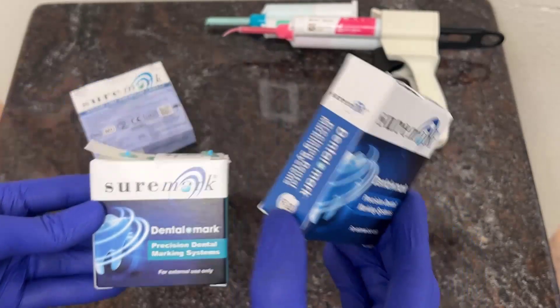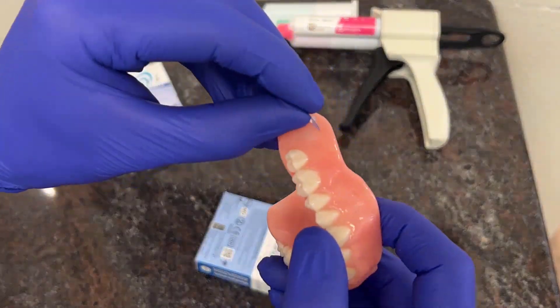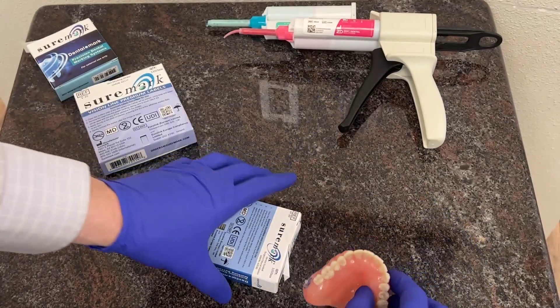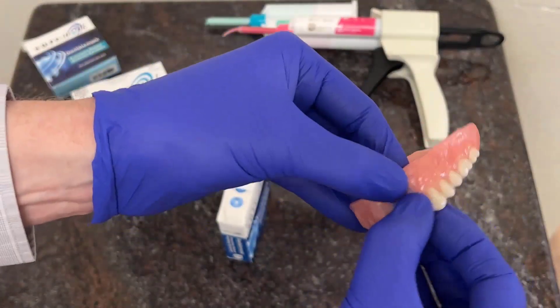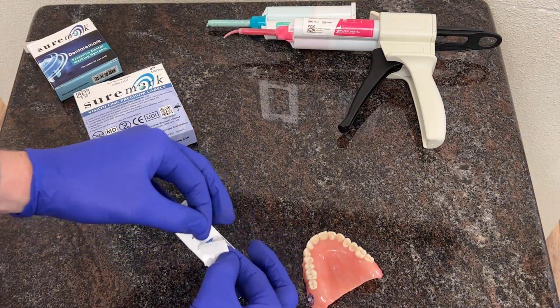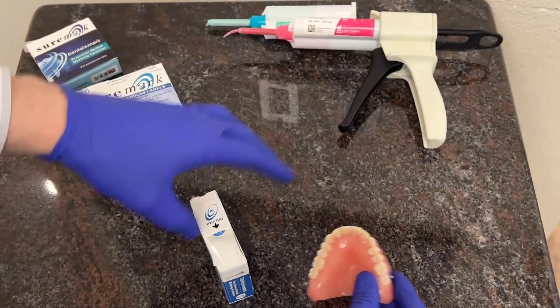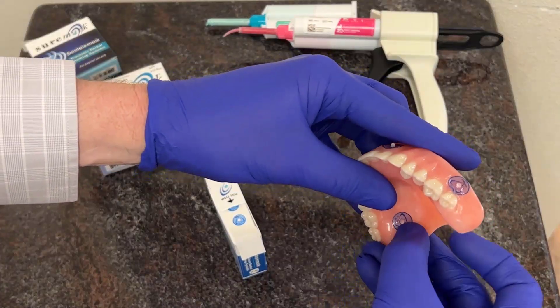I'm going to demonstrate with the 2.0mm stickers. First step is to remove this from the sticker sheet. I typically want to place a series of these around the periphery of the denture. Prior to placing them on the denture, it's a really good idea to make sure the denture is thoroughly dry before attaching them. As a general rule, you want about three of them here on the facial — placing those here, here, and here — continuing forward, one here on the periphery of the border, and then also two to four of them on the inside of the palate.